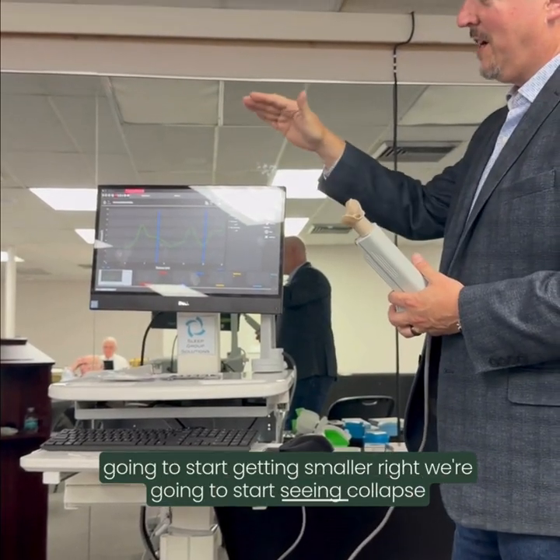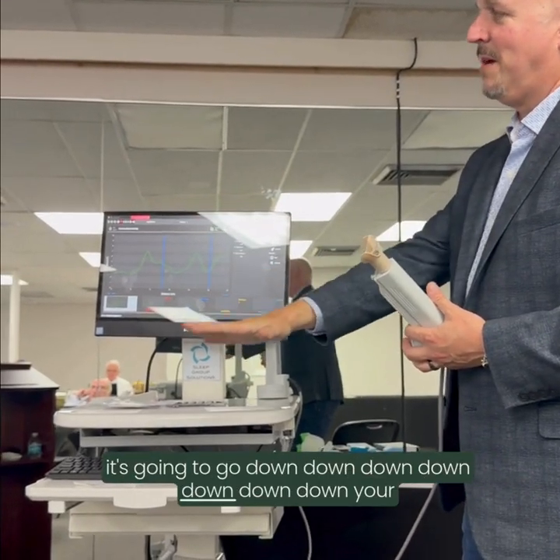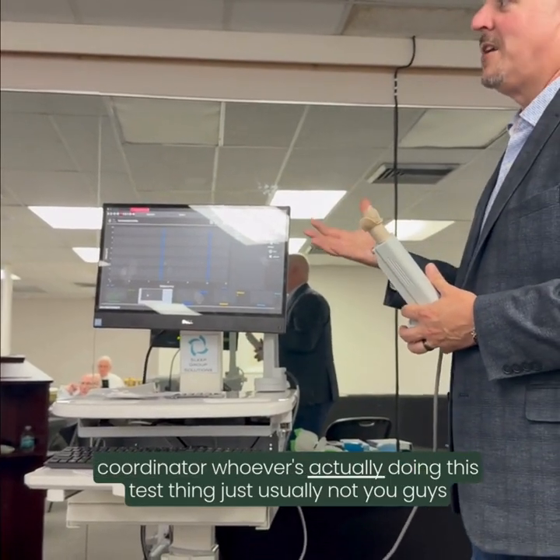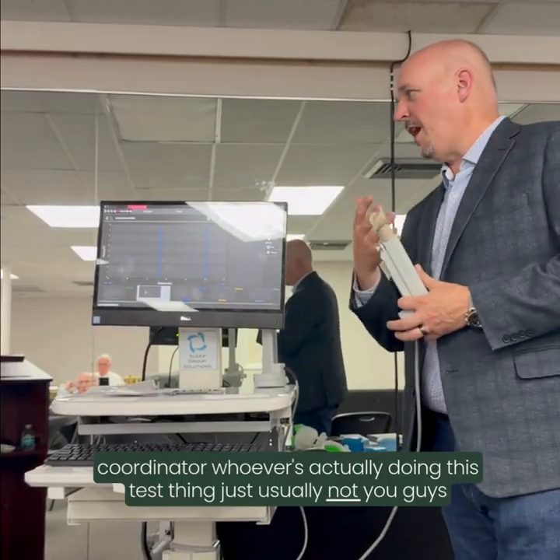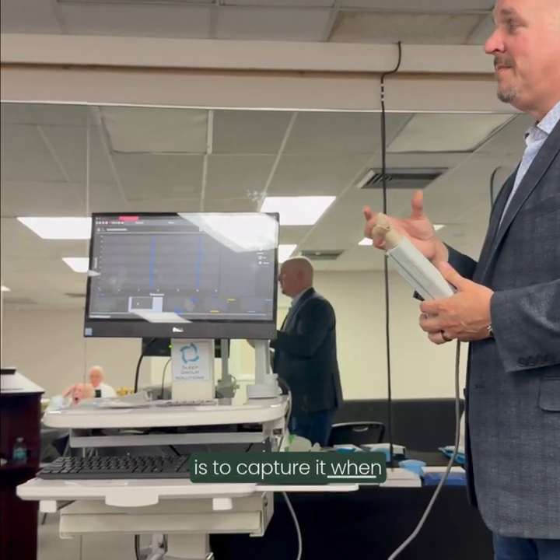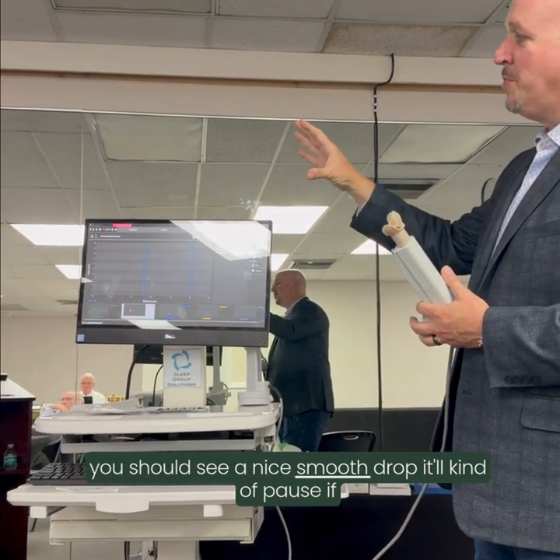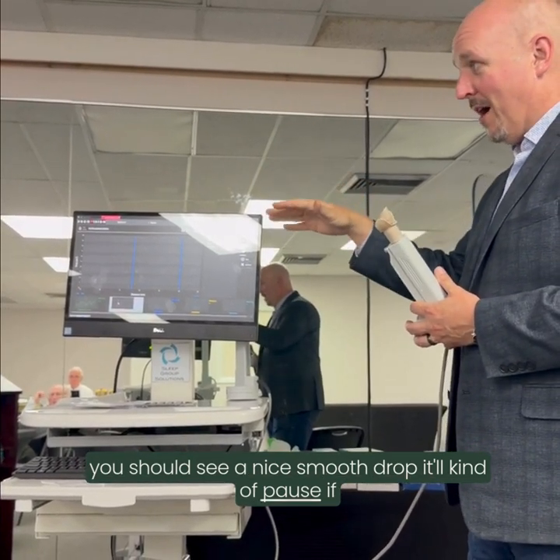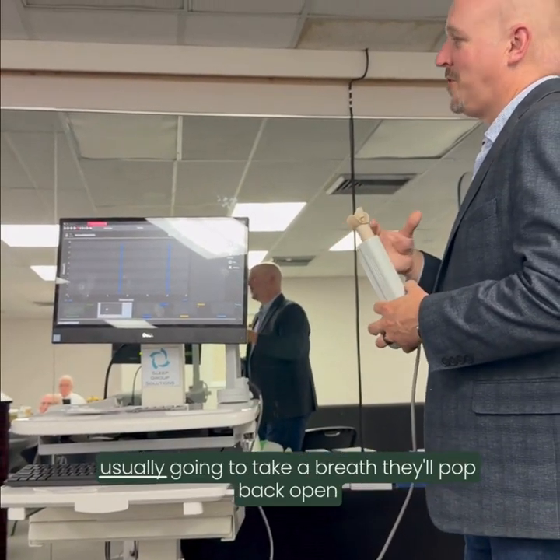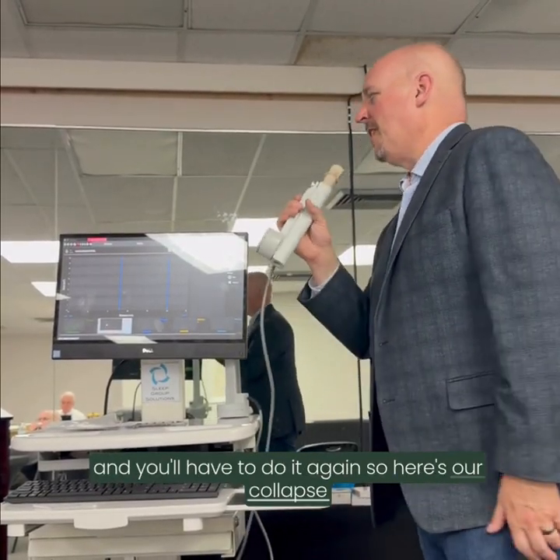And we're going to start seeing collapse. It's going to get narrower and narrower, and it's going to go down, down, down. Your job as the sleep coordinator, whoever's actually doing this testing, usually not you guys, is to capture it when it's collapsed down as low as it's going to go. So you should see a nice smooth drop. It'll kind of pause. If you catch it, that's great. If you push them too long, they're usually going to take a breath. It'll pop back open, and you'll have to do it again. So here's our collapse.